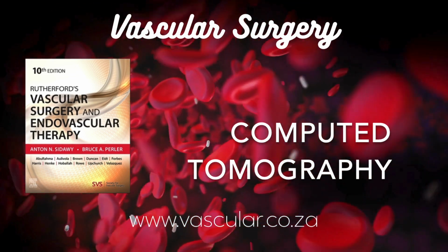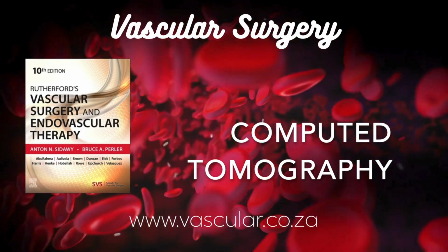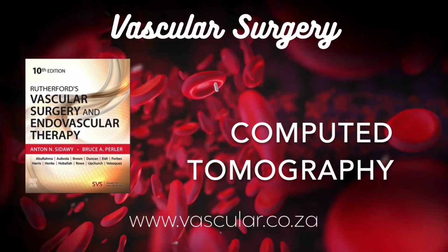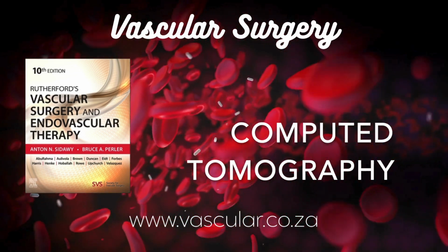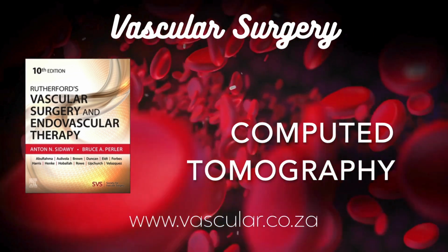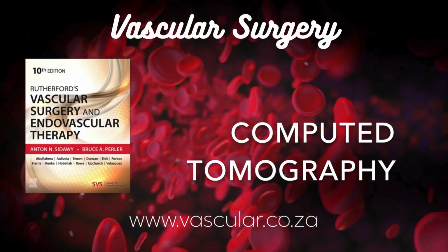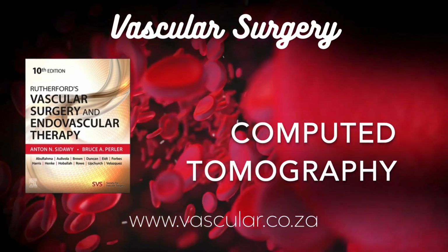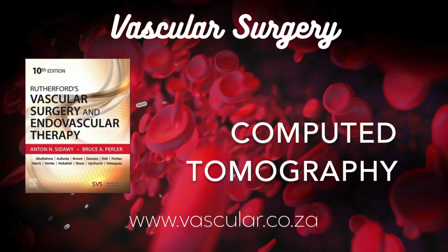Sounds like it's for the heart. Precisely. The heart is always beating, obviously, which causes major motion artifacts if you're trying to image it, or the vessels right next to it, like the coronary arteries or the ascending aorta. So you link the scan to the heartbeat. Yep. You connect ECG leads to the patient, and the scanner uses the electrical signal from the heart to time the X-ray exposures. Are there different ways to do it?